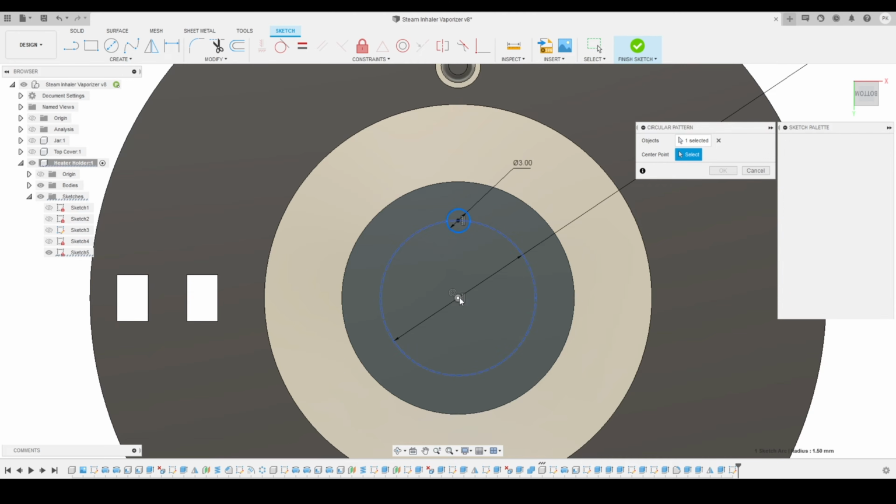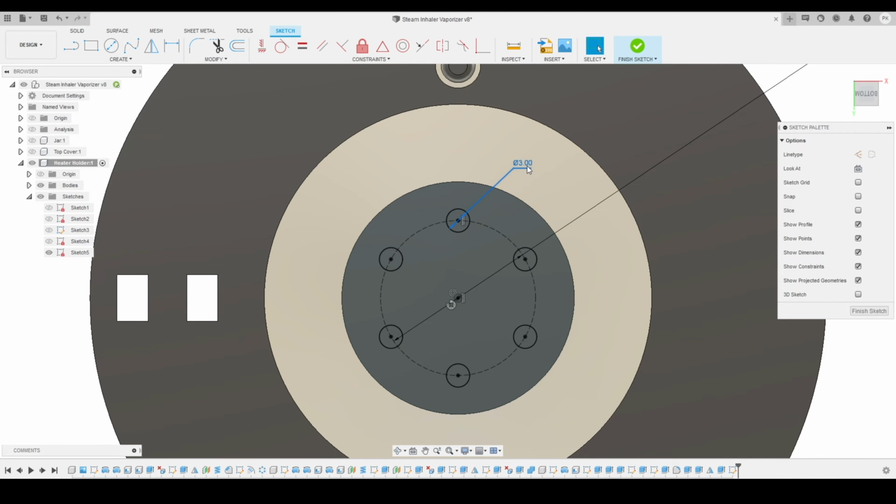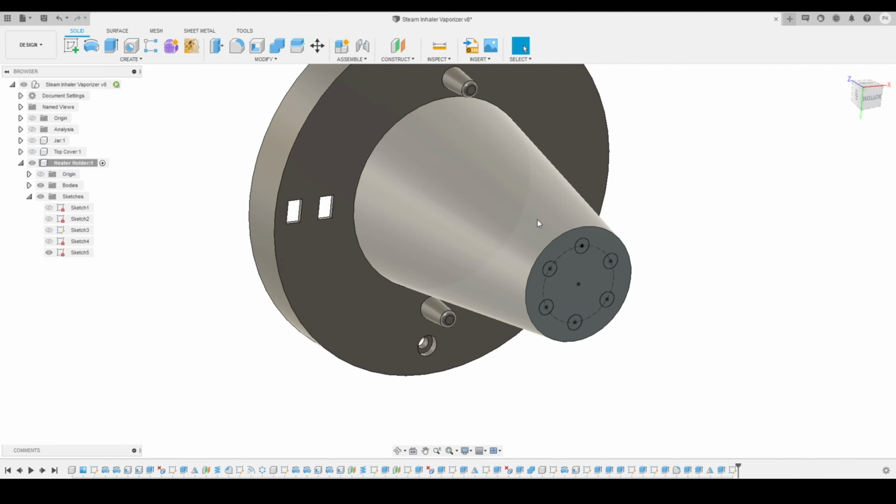Then we'll select the center and give the number of times I want to pattern it. Here I want to keep it 6 times, and we'll press OK. Here you can see I will change the diameter also, and we'll click on finish sketch. So this is what we got.